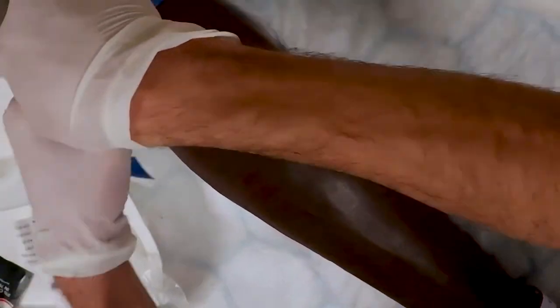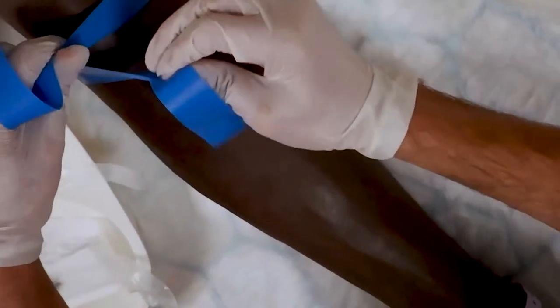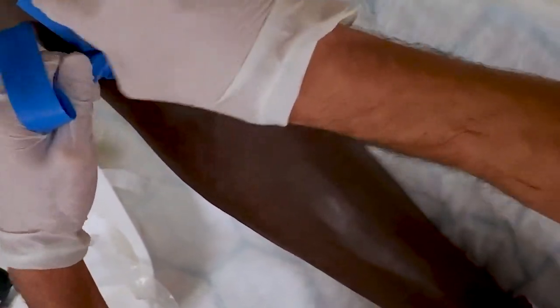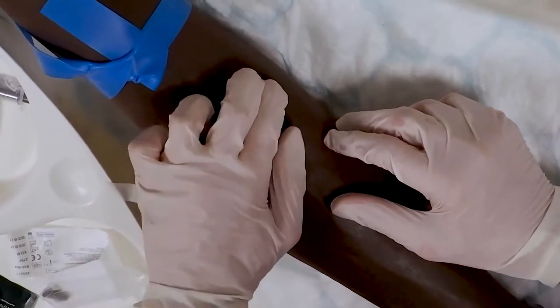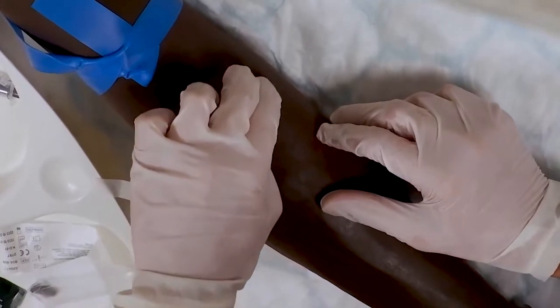Apply the tourniquet seven to eight centimeters above the chosen site. The tourniquet should be tight enough to pinch the skin, but not so tight that it will cause pain. Palpate for a suitable vein if you have not done so already.